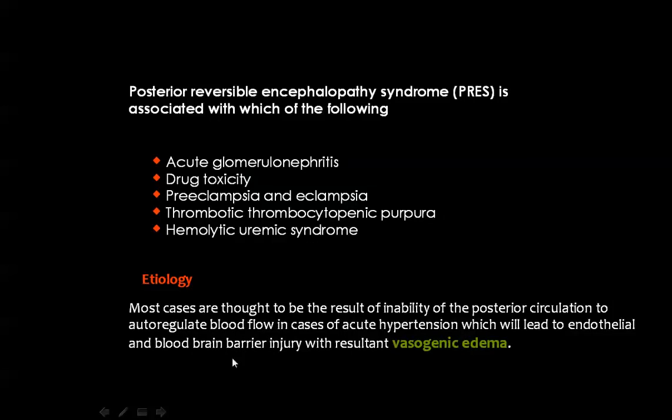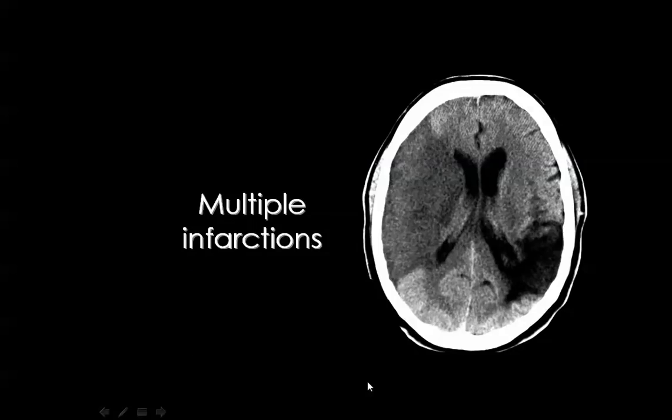And as I have said, this is just a vasogenic edema resulting from severe vascular spasm to counteract the acute rise in the blood pressure to prevent intracranial hemorrhage.